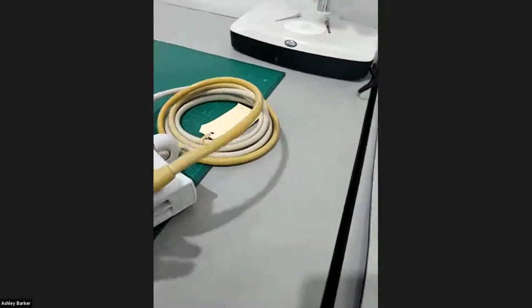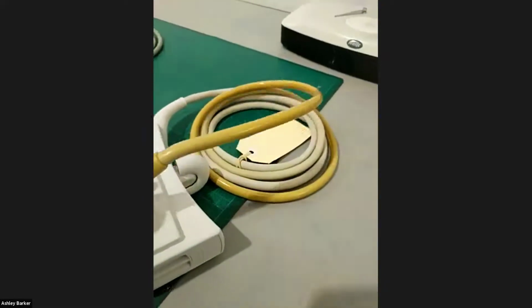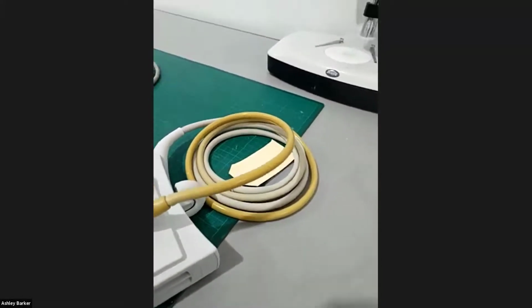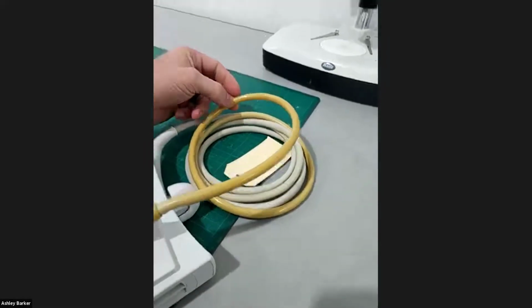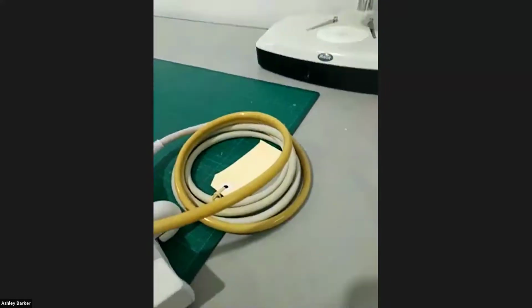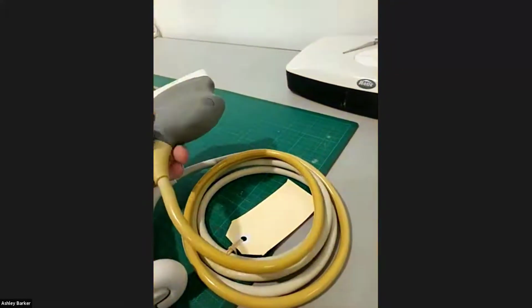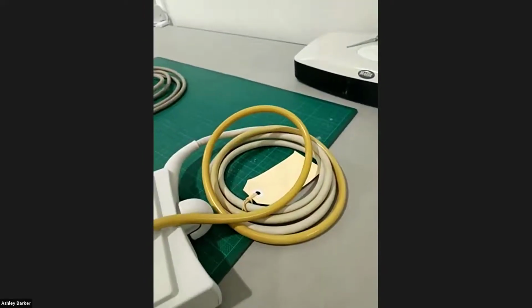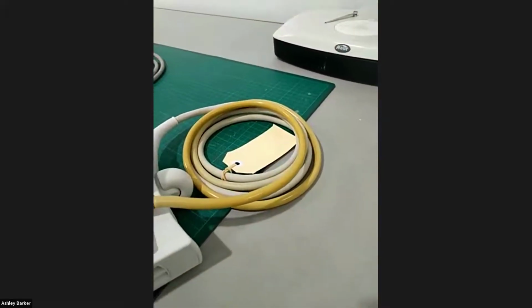This probe here, this is quite a common thing, and I've yet to figure out exactly what causes it, but across the whole of the world and across many clinics, cables turn yellow like this. And like I say, yet to find out what people are doing to actually cause that. It can be fixed, but it just looks nasty. So if anyone has any thoughts on that, I'd really love to know what they think might do it. Some clinics do it and some don't. So maybe it's to do with the cleaning solution or something like that.